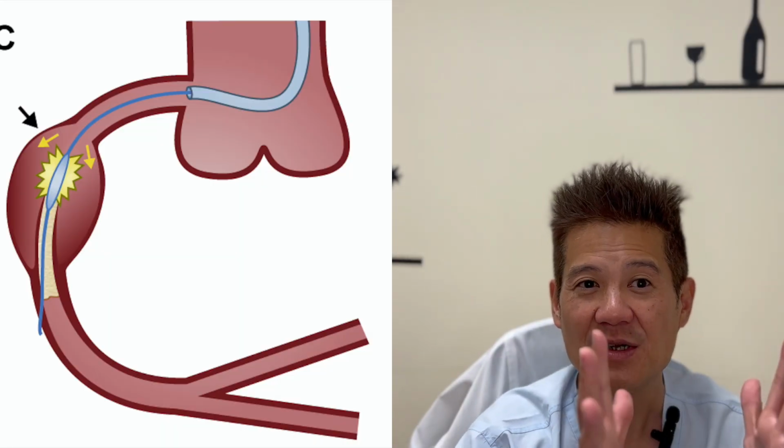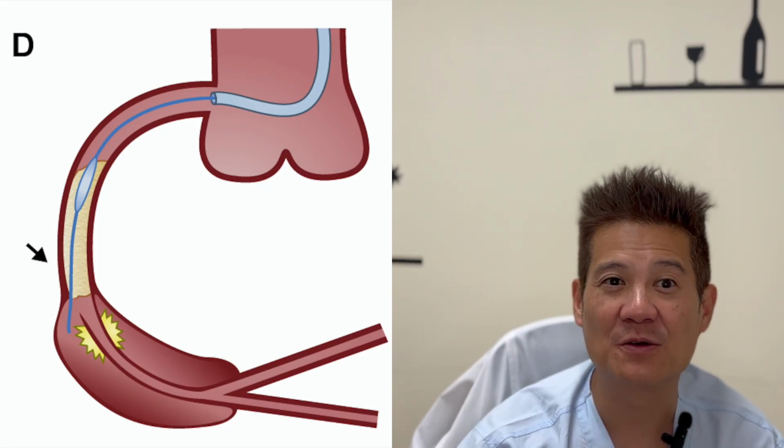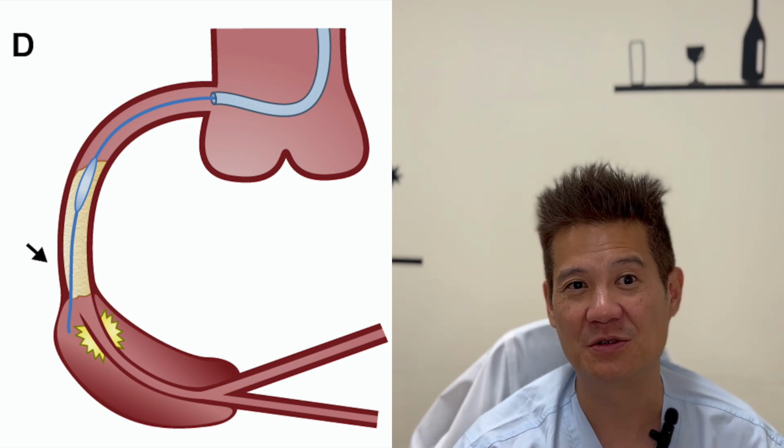Secondly, if you have the CTO body, you can have a hematoma that surrounds the CTO body, and when you stent, the stent becomes smaller, and you can squeeze the hematoma downwards. Finally, the hematoma can go distal and cause distal vessel collapse, so after you stent, you can have no runoff from your CTO body. So that's terrible.